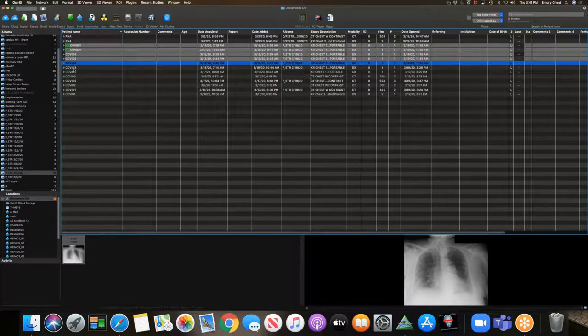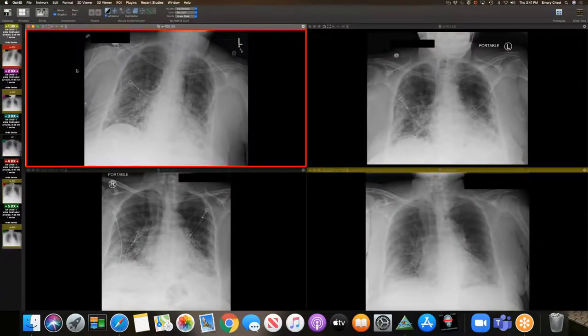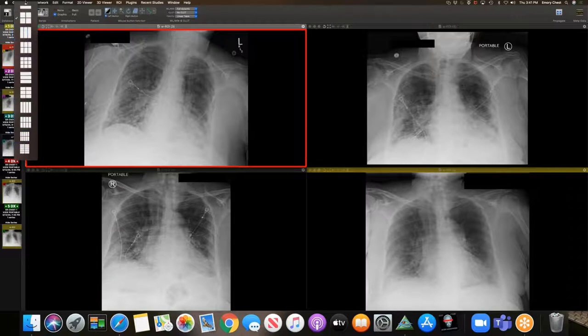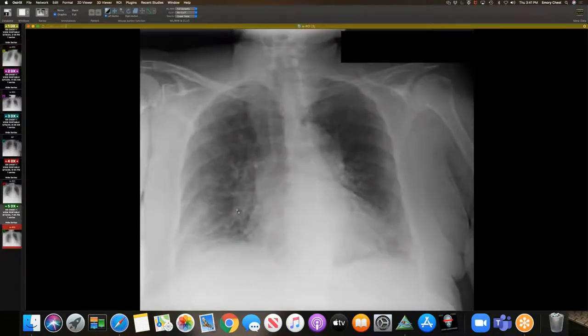So, kind of related to this case, we noticed this radiograph the following day, the same last name. So this happened to be the patient's mother. I'll show the first radiograph. She came in about the same time. On the radiograph, you'd see some peripheral opacities here, some opacities there. Nothing really that specific. Maybe you can argue for subpleural sparing here.